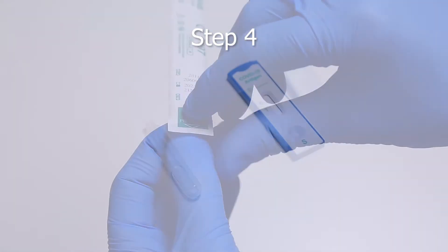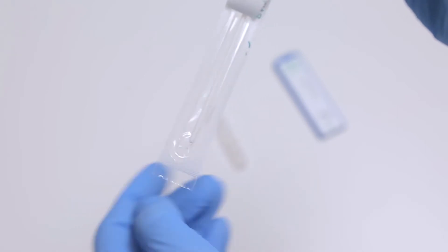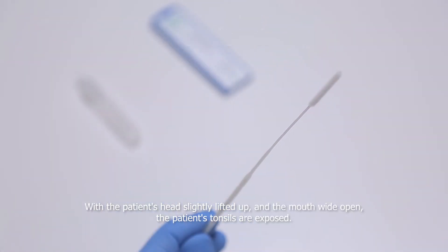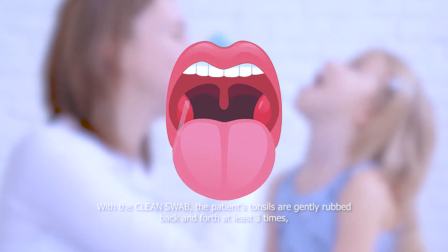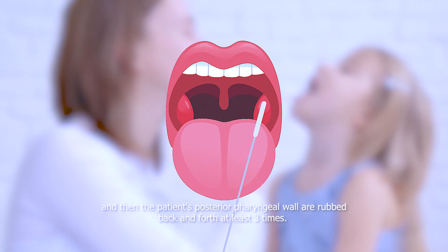Step 4. Open the bag with a swab as it is shown in the picture. Option 1: With the patient's head slightly lifted up and the mouth wide open, the patient's tonsils are exposed. With the clean swab, the patient's tonsils are gently rubbed back and forth at least three times, and then the patient's posterior pharyngeal walls are rubbed back and forth at least three times.